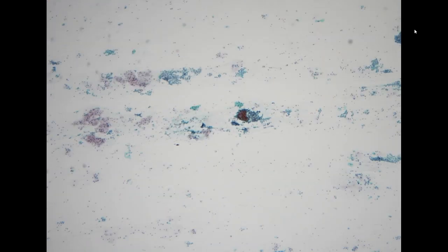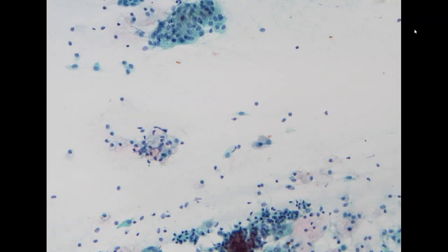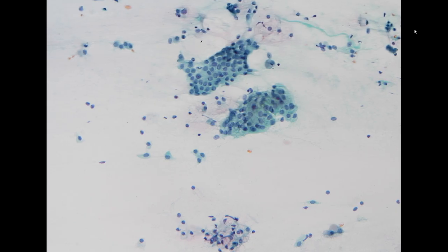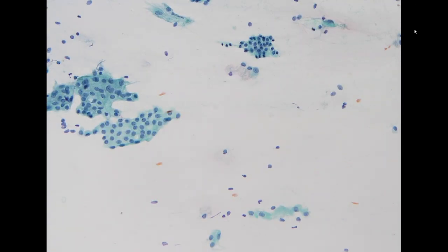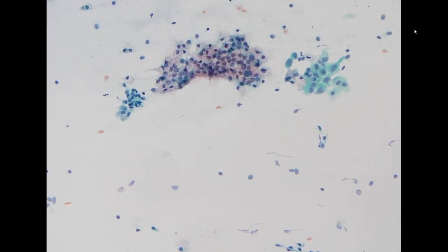Finally, this is even more interesting. 59-year-old female. Again, in the background, you start to see these atrophic type of patterns. So you see more cohesive sheets of these intermediate cells with higher NC ratio and with metaplastic morphology. In the background, you also see a lot of benign cervical glandular cells. So everything looks quite normal.